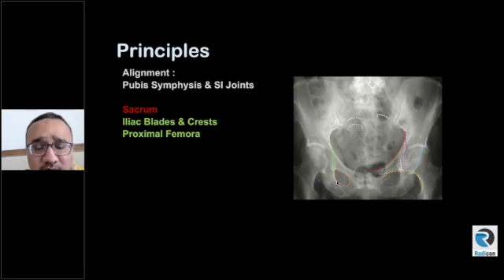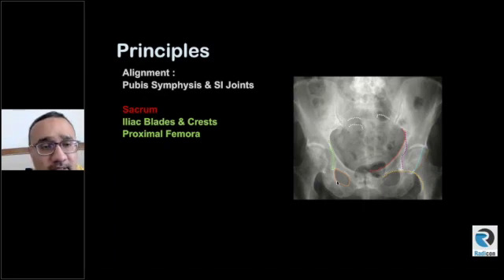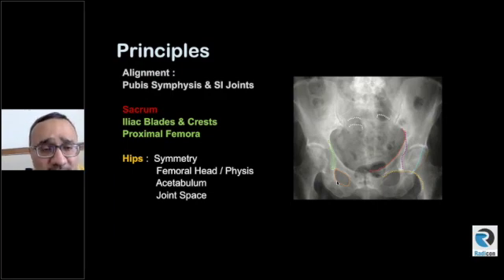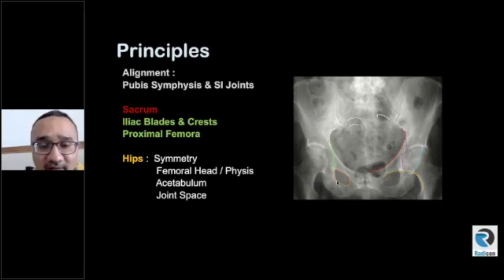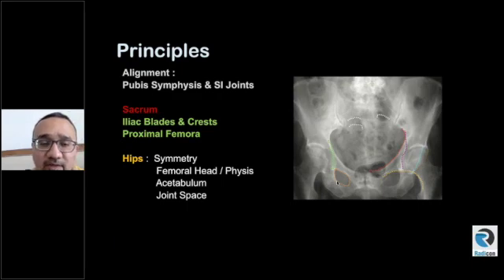Don't forget the proximal femora — they're also part of the film. Obviously, we always look at the hips first. In the hips, compare the symmetry of the joint spaces and the contour of the femoral heads. In skeletally immature patients, always look at the physis for any abnormality such as a slip or overlap. Don't forget the acetabulum, as things can hide there too. For joint spaces, always compare one side with the other and see whether it is a focal joint space loss affecting the superior aspect of the joint, or whether it is concentric or diffuse joint space loss.